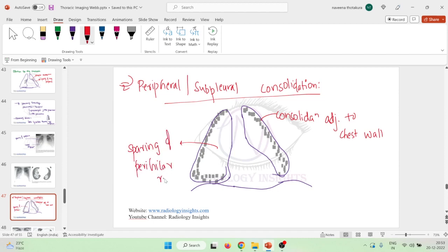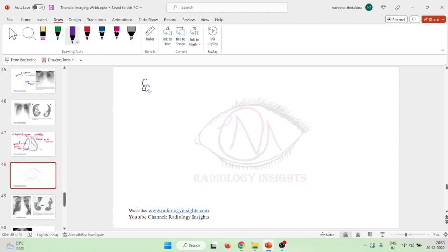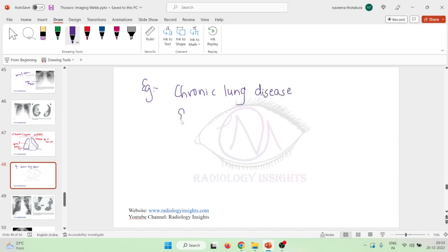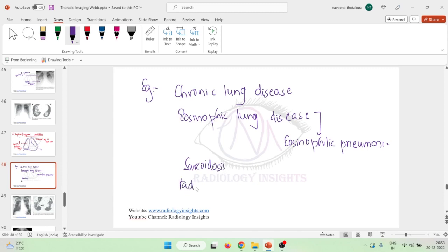The examples of peripheral or subpleural consolidation — it is mainly seen in patients with chronic lung disease, and it is seen in eosinophilic diseases, especially in the eosinophilic spectrum of lung diseases. It is also seen in certain conditions like sarcoidosis.